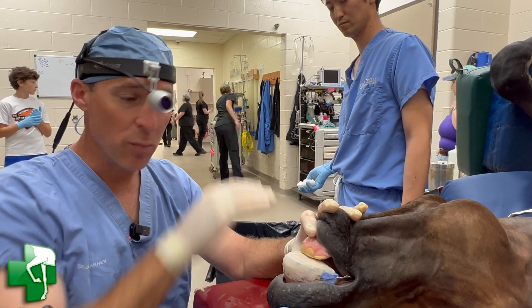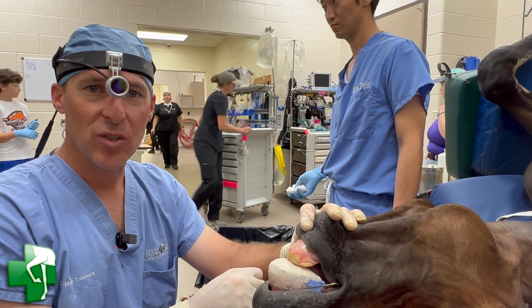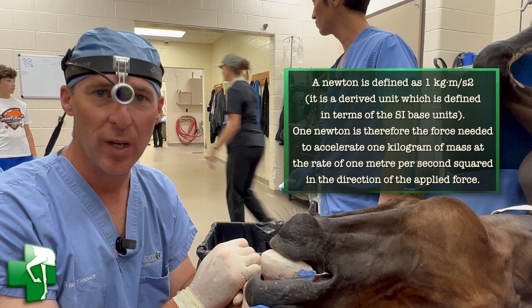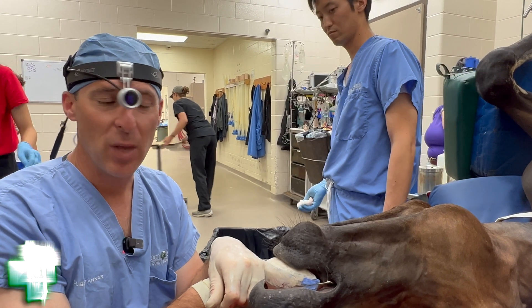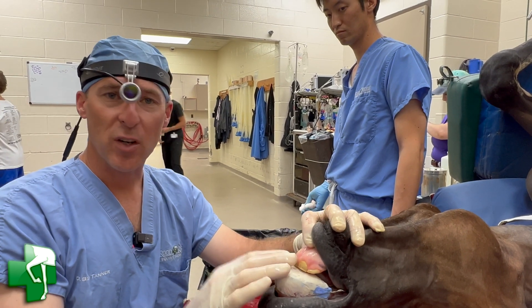We do that in a way that provides an incline plane. The incline plane will now engage the mandibular incisors, pulling them forward. We know from orthodontics in humans that it only takes six newtons of force to move a tooth — that's why little tiny rubber bands on your kid's teeth are enough to move teeth left, right, front to back. Every time this horse chews, these teeth are going to be pulled forward.